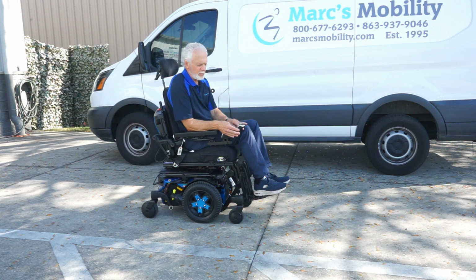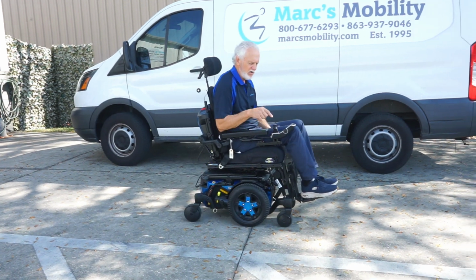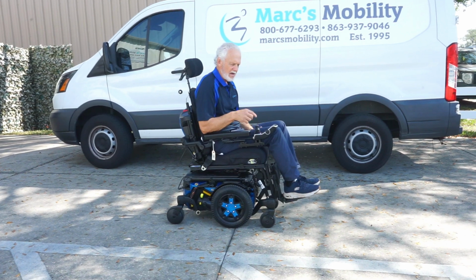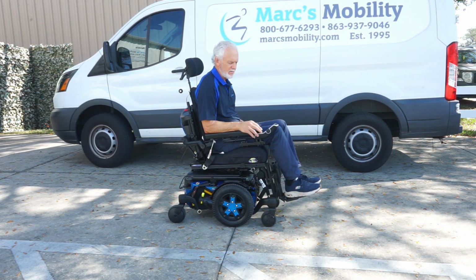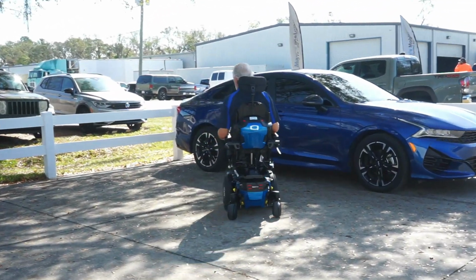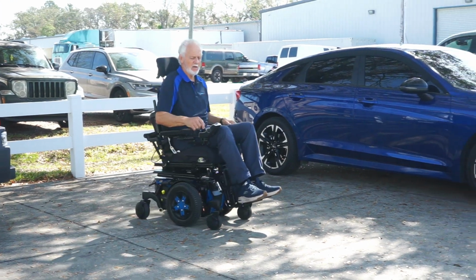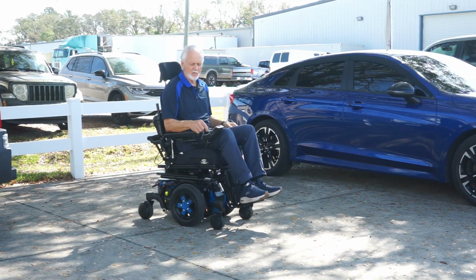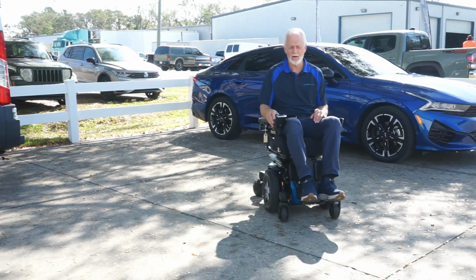You can reduce the speed here where it only goes this fast. See what I mean? Barely goes. Or you can control the speed here. I like to keep it on fast and just control the speed like a gas pedal right here. This chair is very easy to drive. It wouldn't take you but about a few minutes to learn how to drive. Even if I do this, it doesn't go anywhere. It takes about a second to respond, or half a second, I should say.